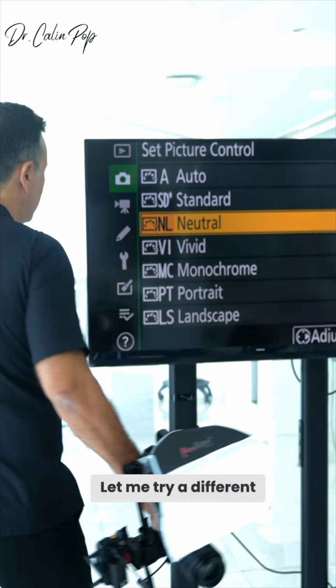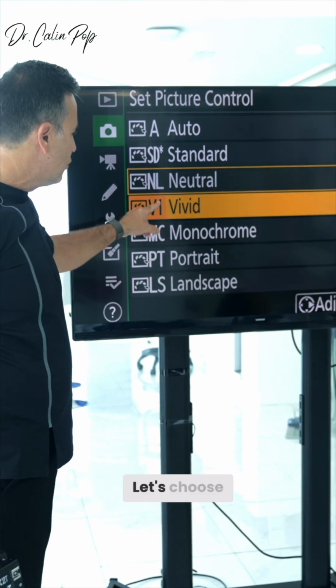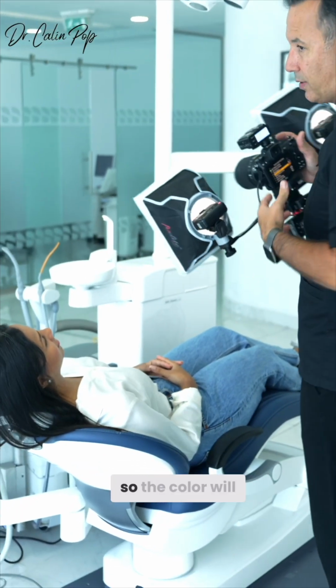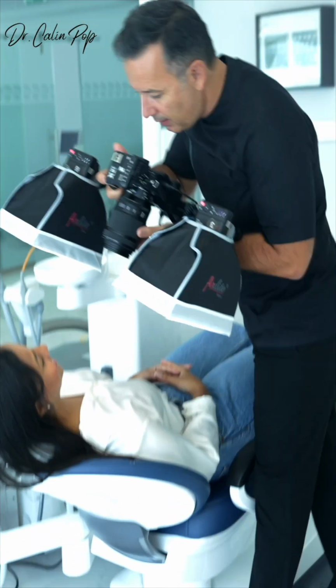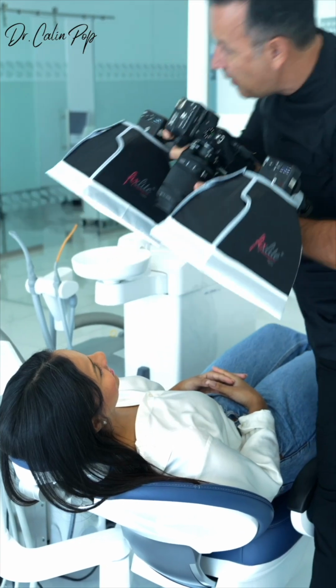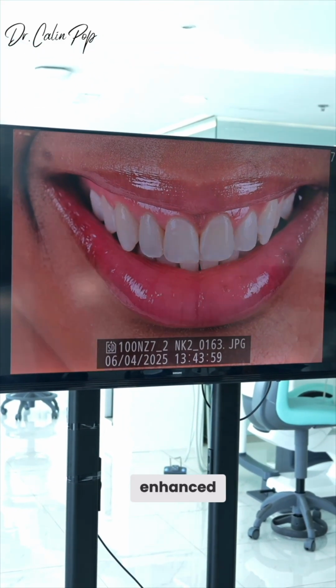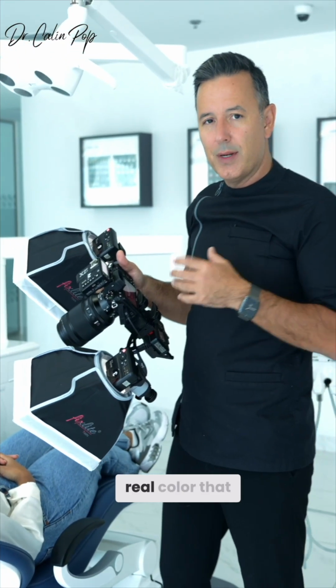Let me try a different profile. Let's choose vivid. I expect from the name that I will have too much saturation, so the color will be exaggerated. If you notice now the colors are enhanced, and in my opinion this is too much. This is not the real color that I see.